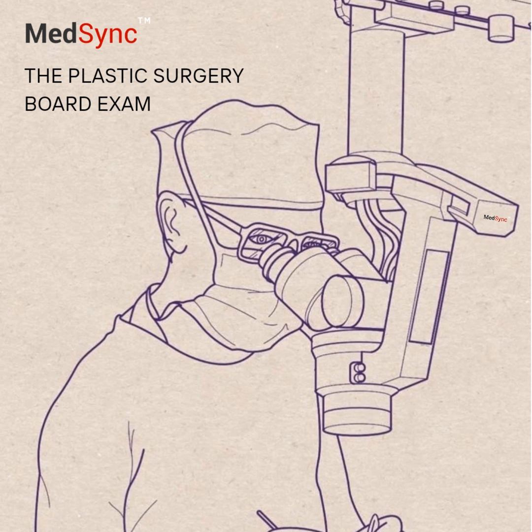Okay, that covers application well. Now let's pivot to indications and contraindications. Yeah. When should we use NPWT? It's got a pretty broad range, useful for many wound types. Chronic wounds like ulcers: diabetic, pressure, venous. Also acute and traumatic wounds, dehisced surgical wounds, partial thickness burns, and as an adjunct for flaps and grafts.